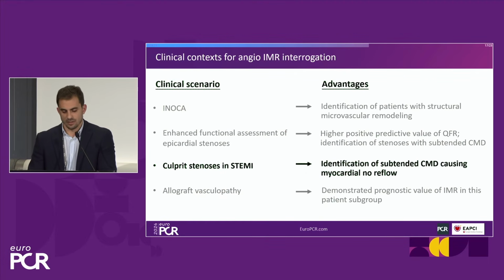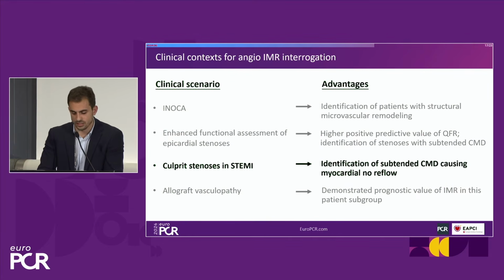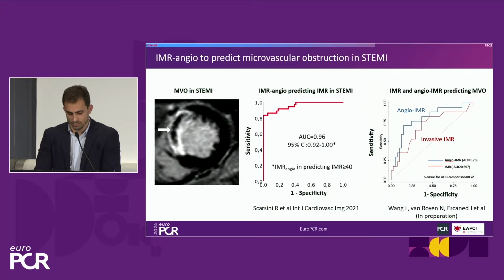Then another possible application of angio-IMR techniques is the culprit stenosis in STEMI and the identification of coronary microvascular dysfunction in this subset of patients.